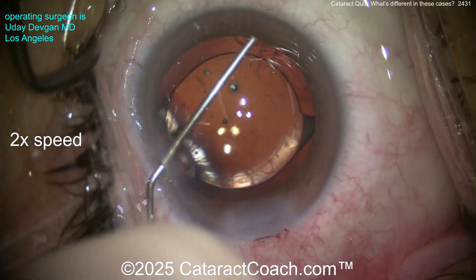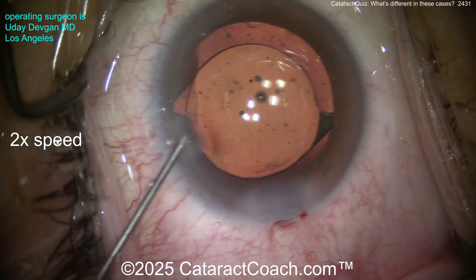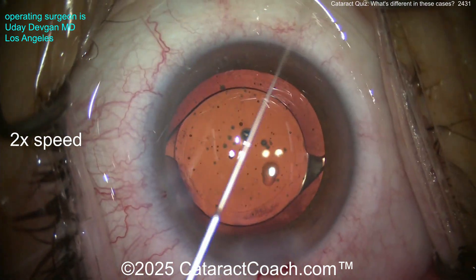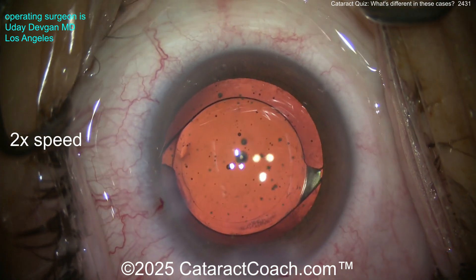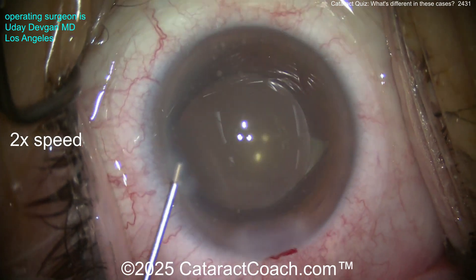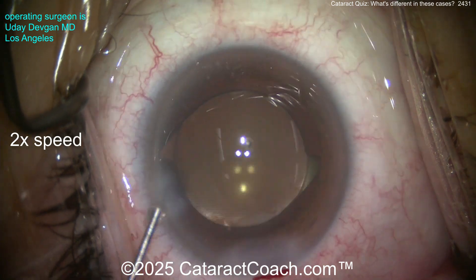Make sure there is no vitreous prolapse — I'm positive there is not, but we'll prove it. There's a nice overlap — look how the rexis is still nice and round. Remember, if the rexis turns to an oval or a D shape, the straight part of the letter D is where you'd have significant zonular loss. Here, triamcinolone staining shows nothing — everything looks fantastic.